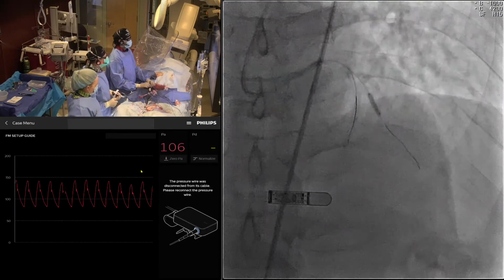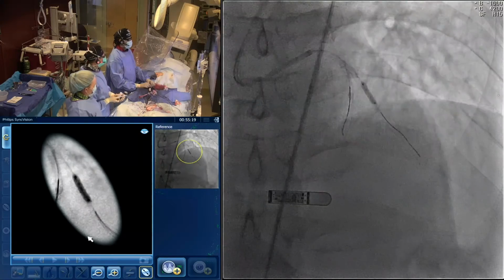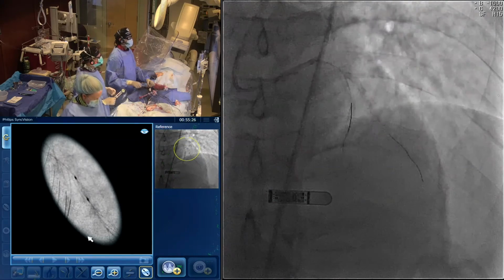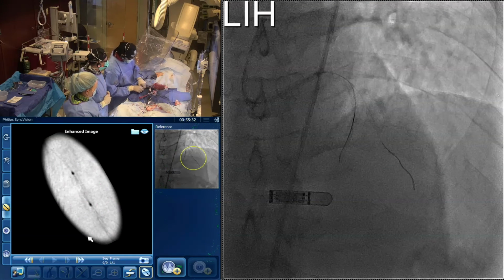18. That looks pretty good. That looks great. That's like IVUS, man. Full expansion. Want to see the poor man's IVUS? There it is. There's the poor man's IVUS for you. Nice. You saw it here first on camera. Wow. Now I'm pretty excited, man. Moment of truth. Moment of truth, indeed.